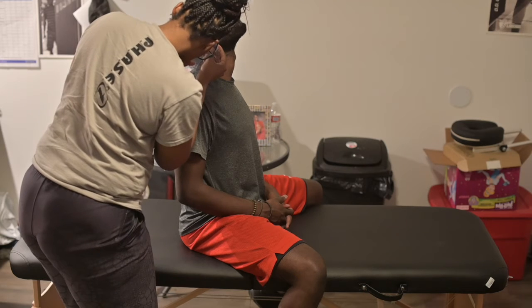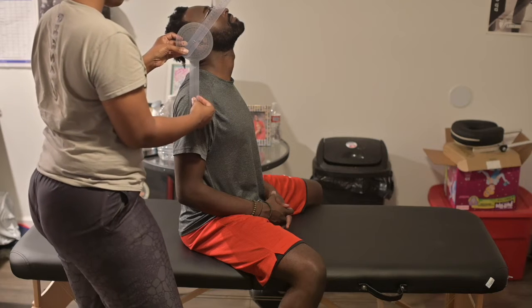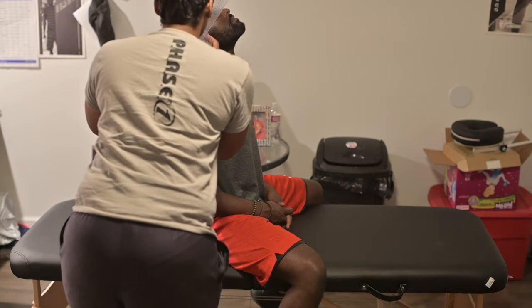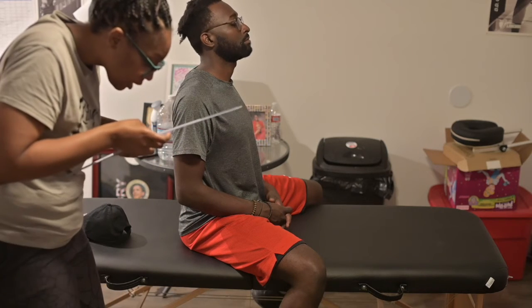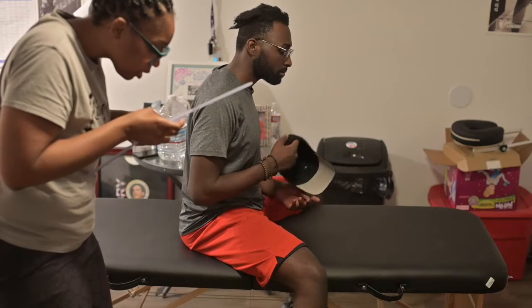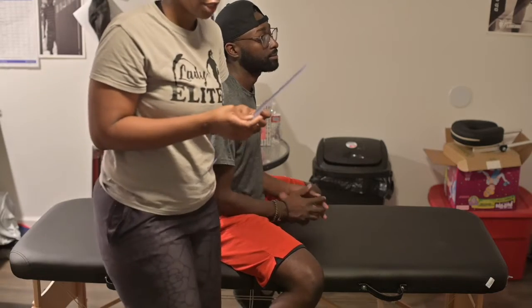So we're measuring at 56 degrees of cervical extension.